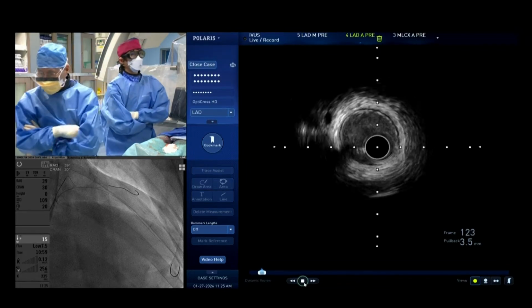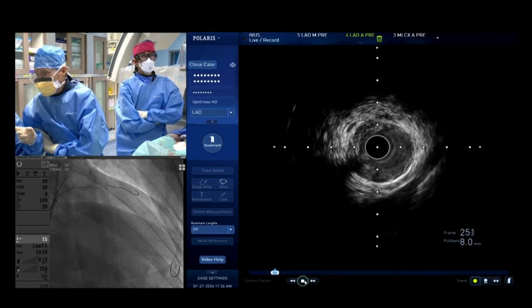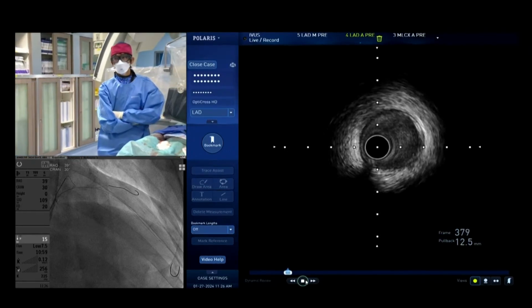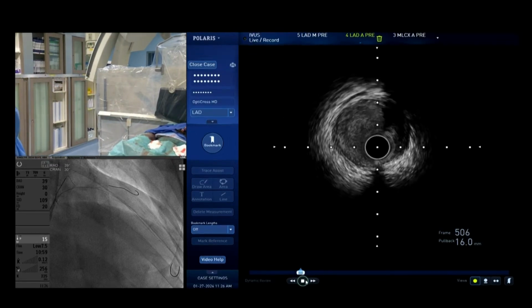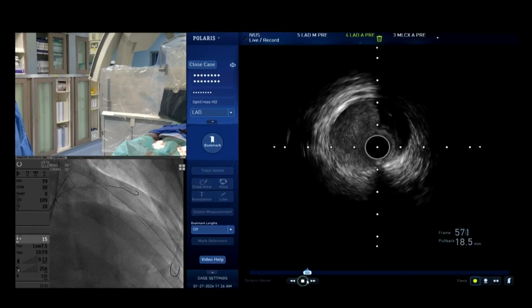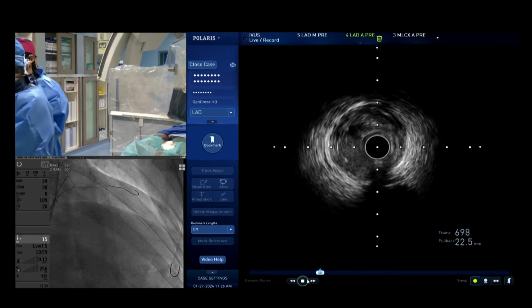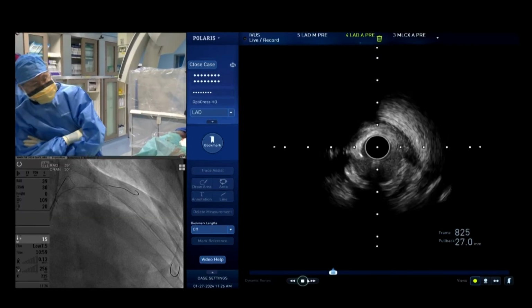No, it's just a stent in the LAD ISR. So I think if there's the left main, that flap there, no, that one has to be covered with a stent. For safety reasons, you have to do it stented. I think there's pretty much broad agreement, Prof. Ko and John, that in the setting of that flap that you showed, we probably would prefer to put a stent.